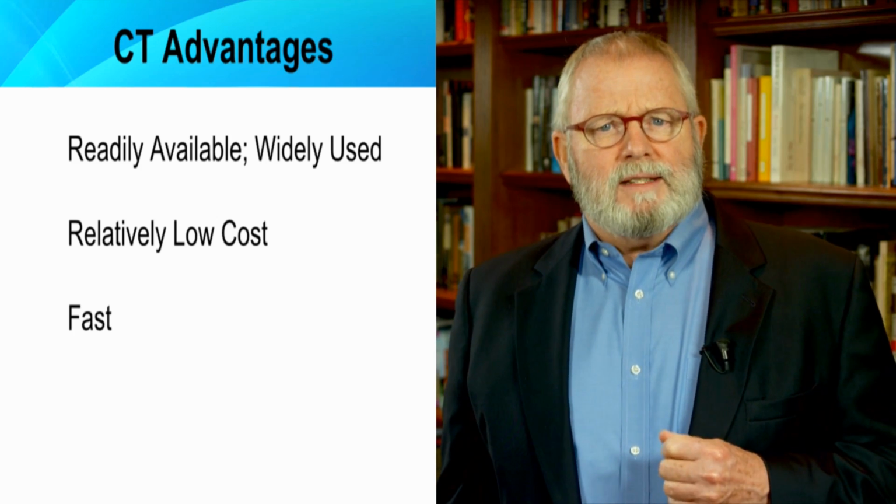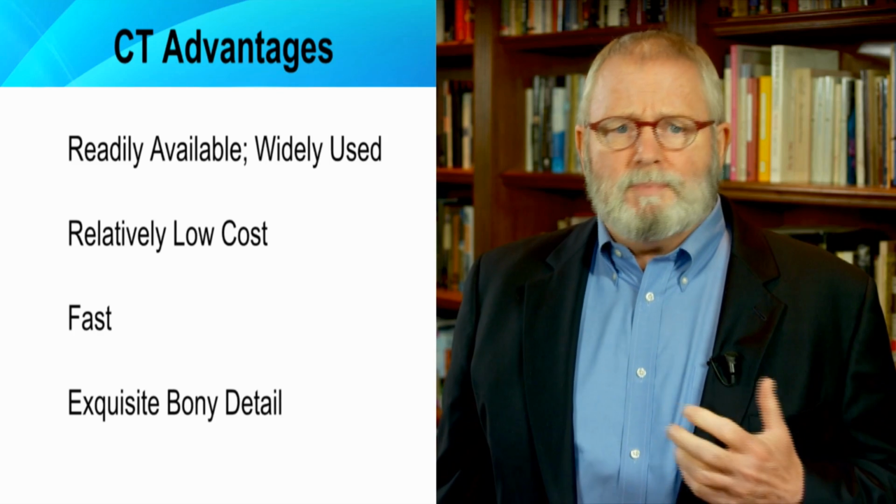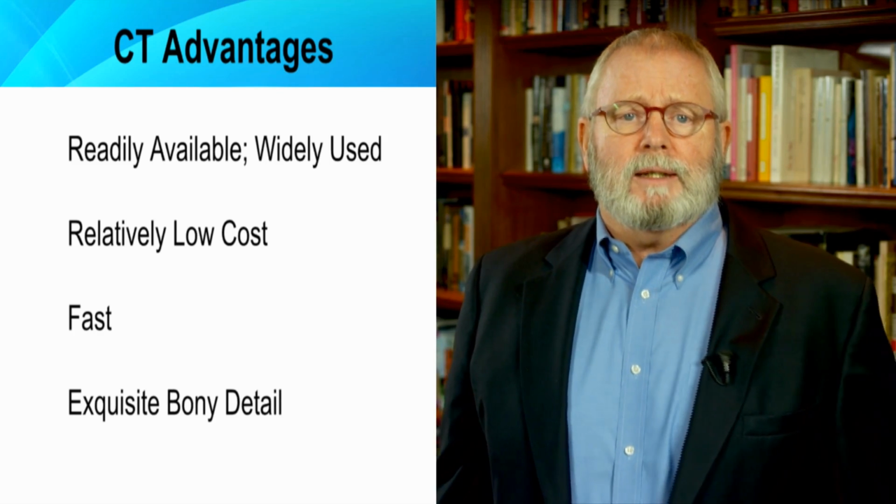CT scanning provides excellent bony detail and is especially useful when evaluating the middle ear and mastoid. It can determine the position and patency of the round and oval windows, catalog the anatomic changes associated with congenital syndromes, and identify the signs and symptoms of both acute and chronic infectious processes. CT scanning is clearly the imaging modality of choice when detailed anatomy of the facial nerve is needed.